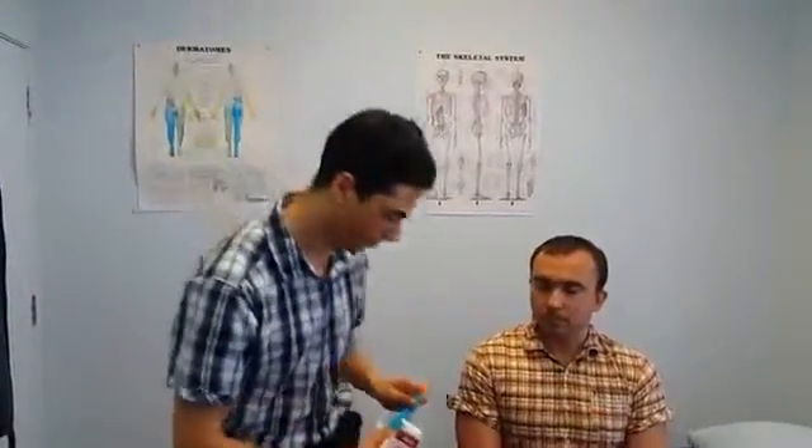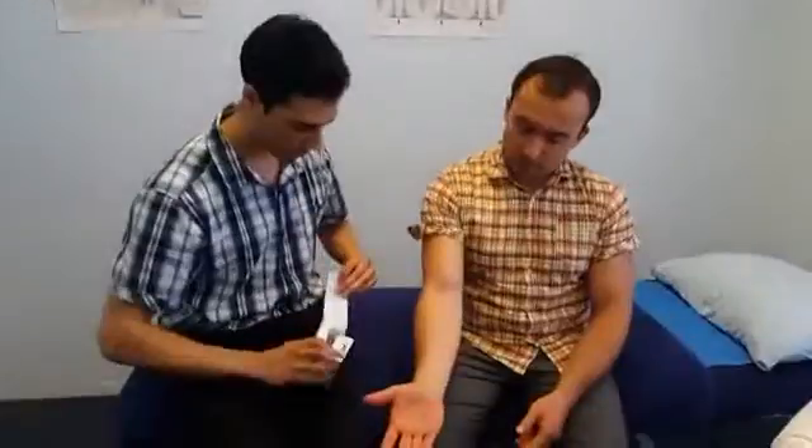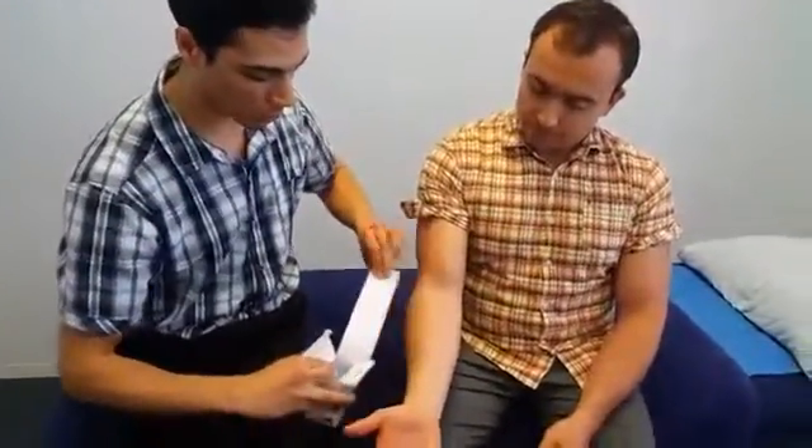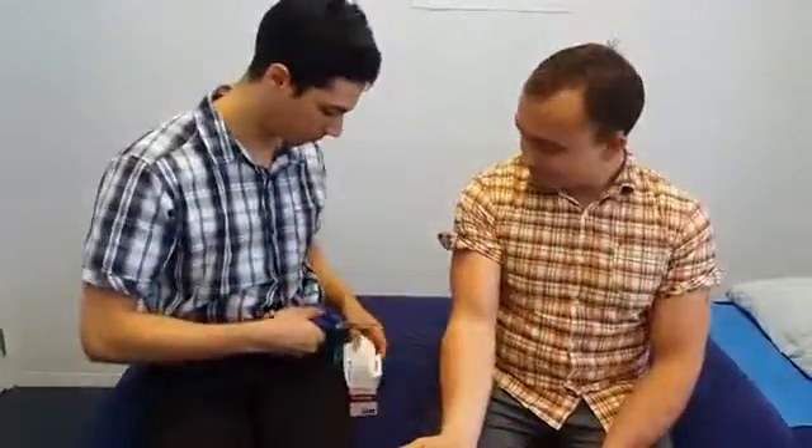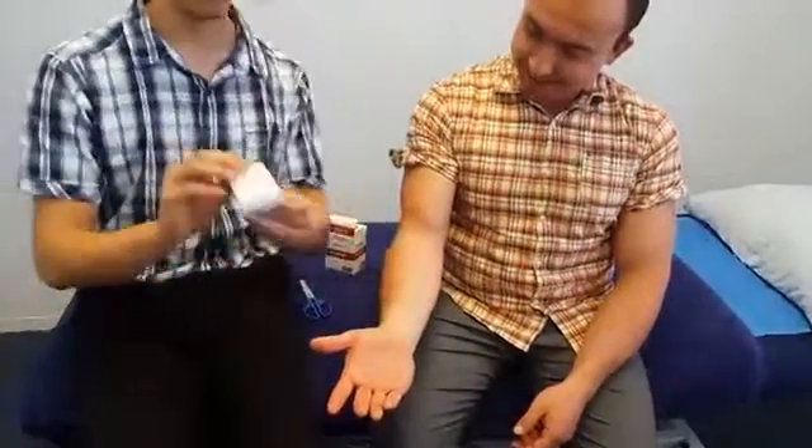We're going to try that very same technique on Alex. First things first, we're going to take a piece of K-Tape and measure it along the majority of the forearm — it has to cover most of the forearm. Then I'm going to fold it in half and make a cut down the center, about five centimeters long.